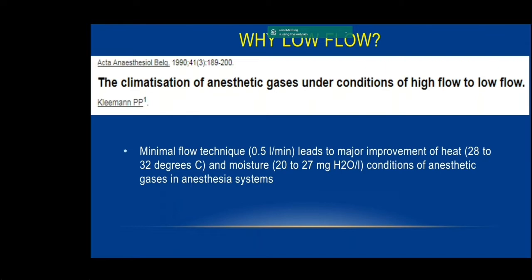Instead, if you have a technique by which you can give humidified gases which are warm, there is always better homeostasis of temperature, less hypothermia, and the moist as well as heated air will preserve the function of respiratory epithelium and will not cause post-op pulmonary complications. So it's more physiological to give low flow anesthesia.